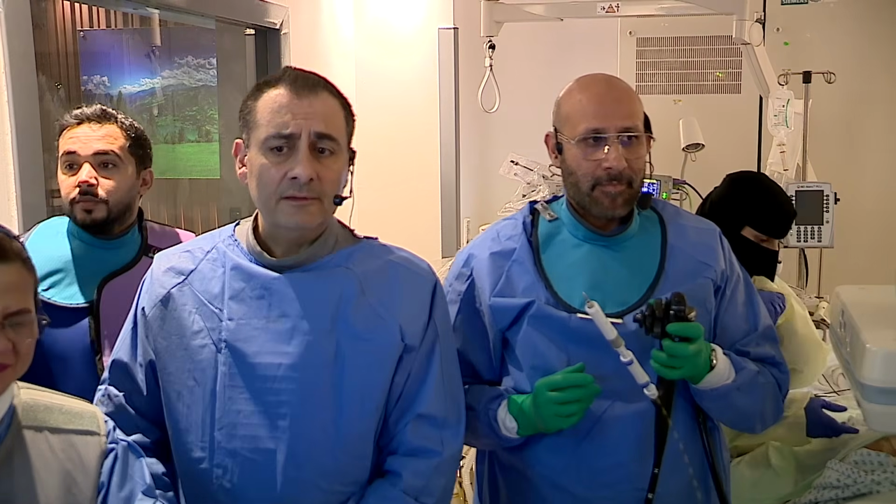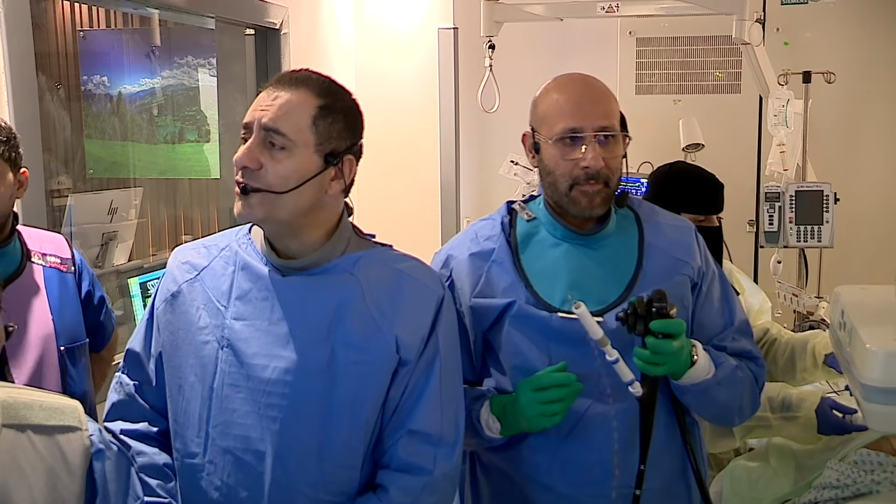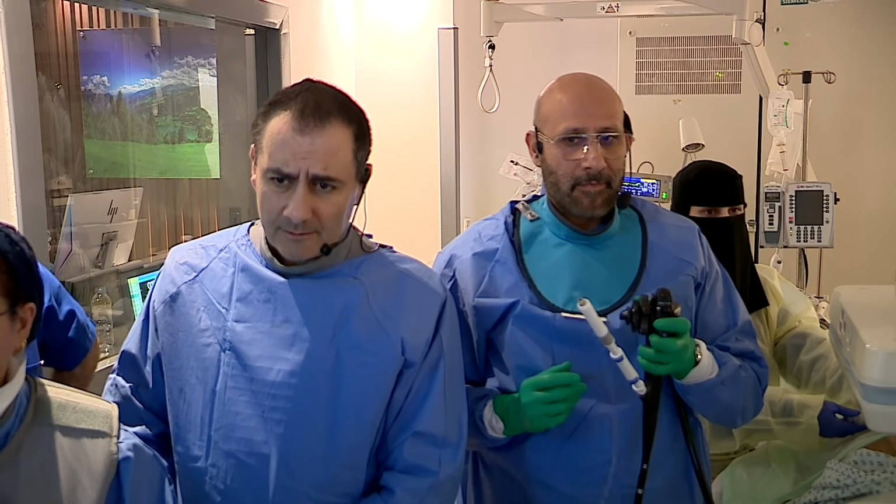We live? Okay, can you guys see us? Yes, we have. Okay, can we show the fluoroscopy, please? Tell us what you are working on.